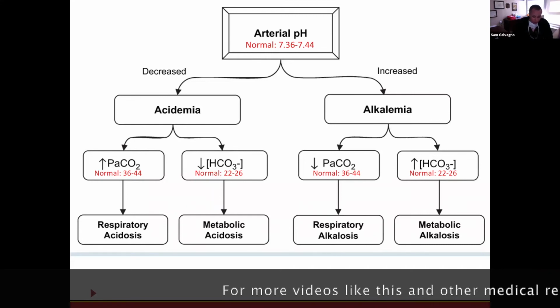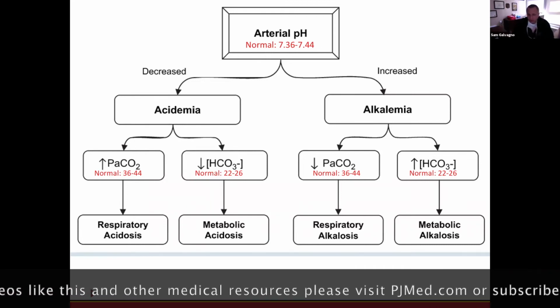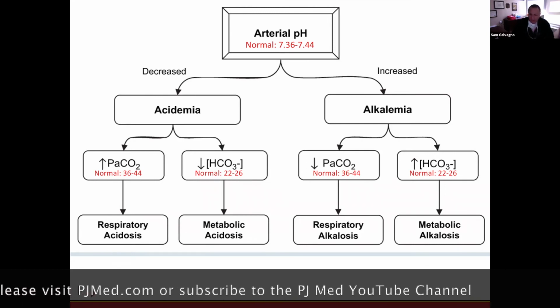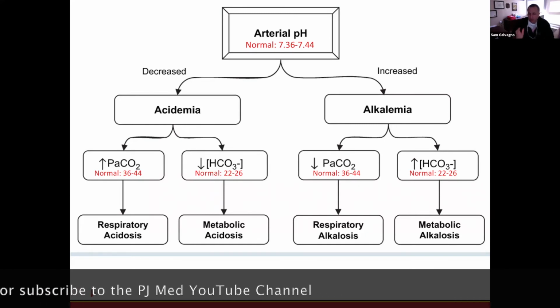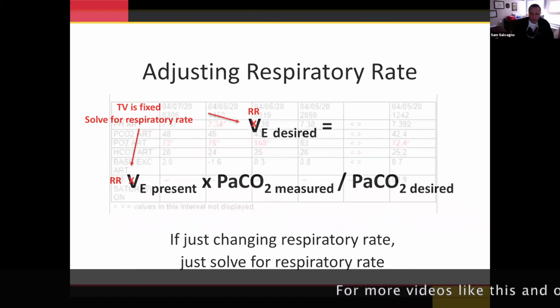And furthermore, if you're doing long-term work, and I know several of you, like the Alaska guys, do these transports. If you're going to be doing transports on ventilation, this is the kind of stuff you're going to be doing en route, making small adjustments, okay? That's what our critical care transport guys do here in Maryland when they're going hospital to hospital. So there's the formula again. You know how to do that.